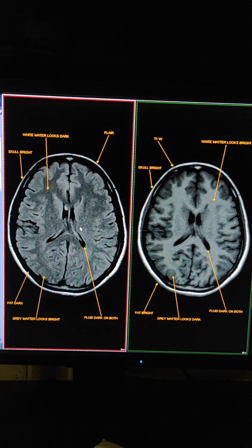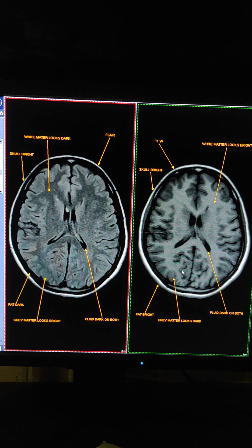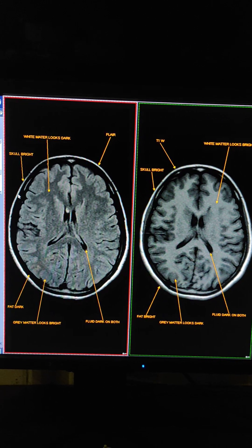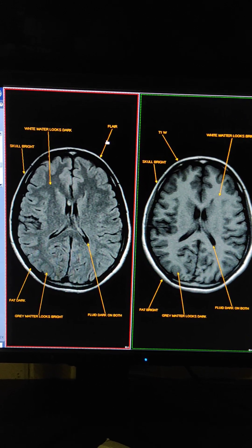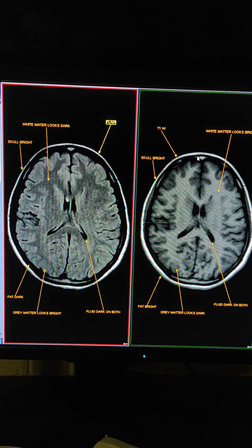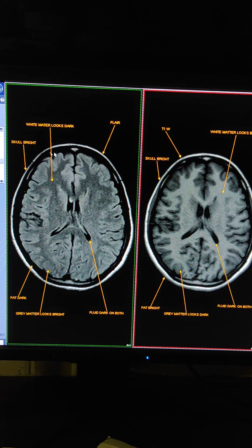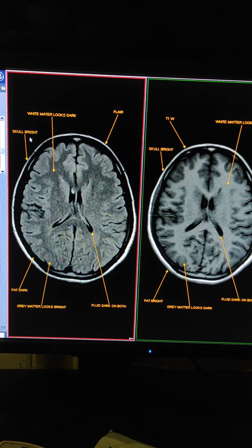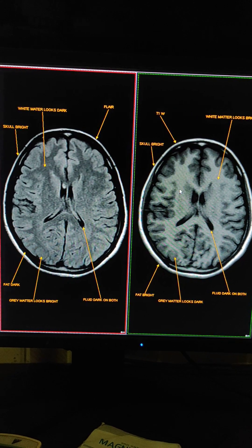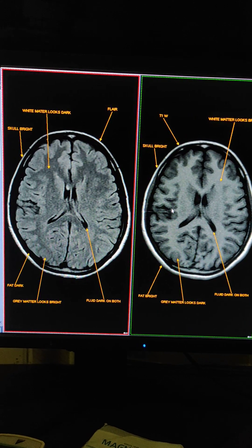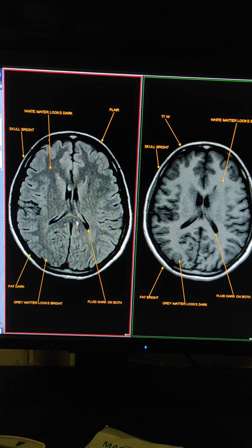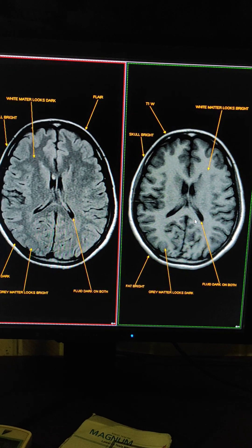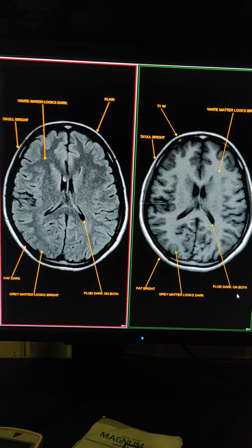First, I will show you the similarities between these two sequences. We can start from the skull. In FLAIR sequence, the skull is bright. In T1 weighted sequence, the skull is also bright. In FLAIR sequence, fluid is dark. In T1 weighted sequence, fluid is also dark.